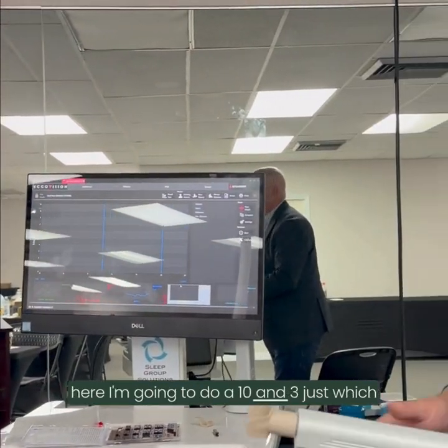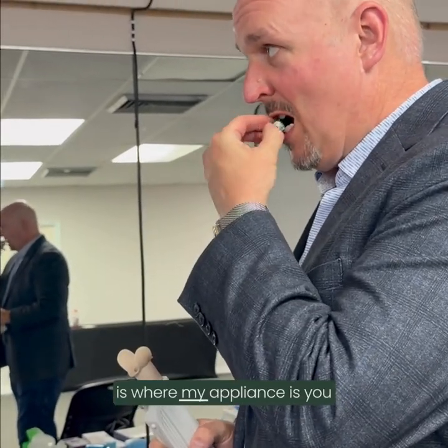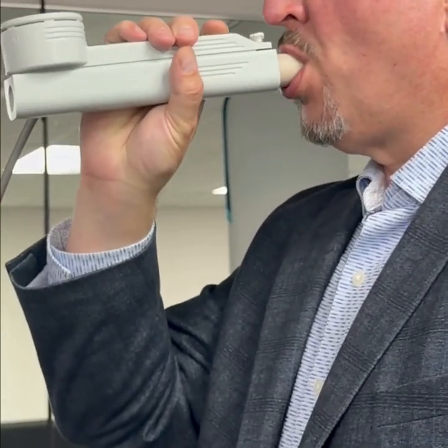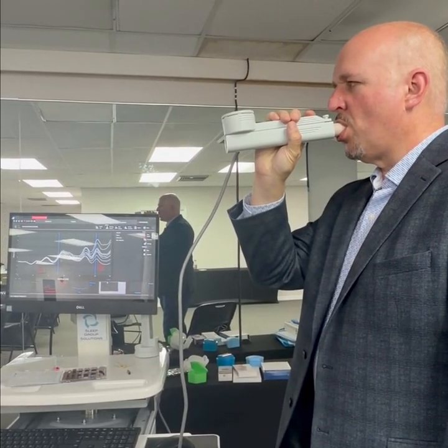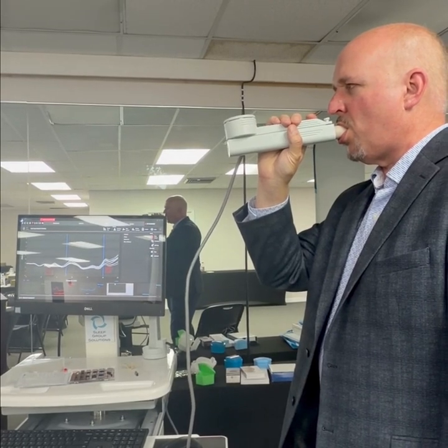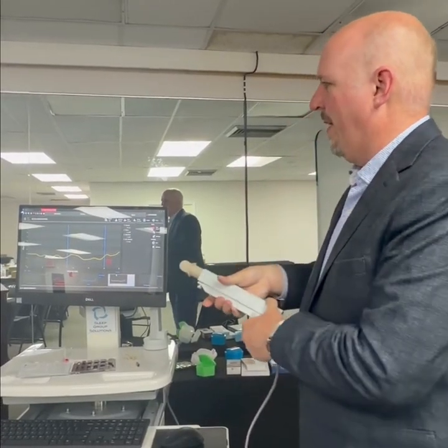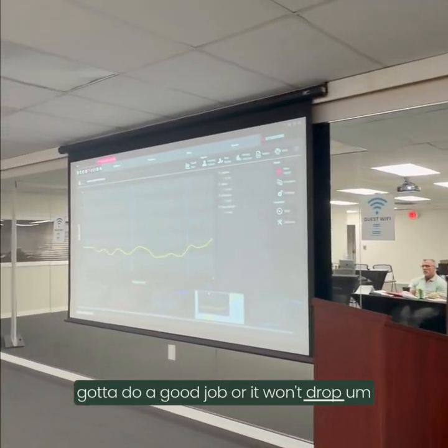But here, I'm gonna do a 10 and 3, which is where my appliance is. All right. A lot of air in there, buddy. You got to do a good job or it won't drop.